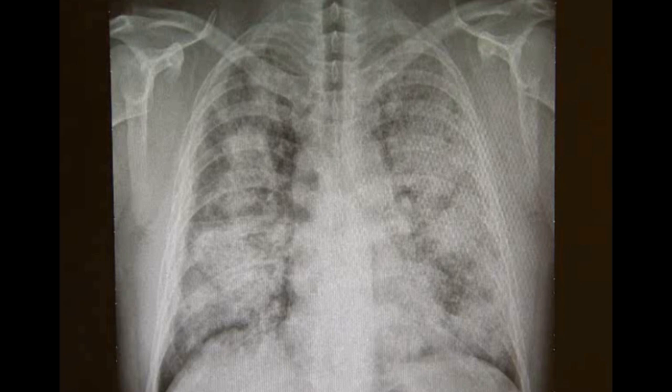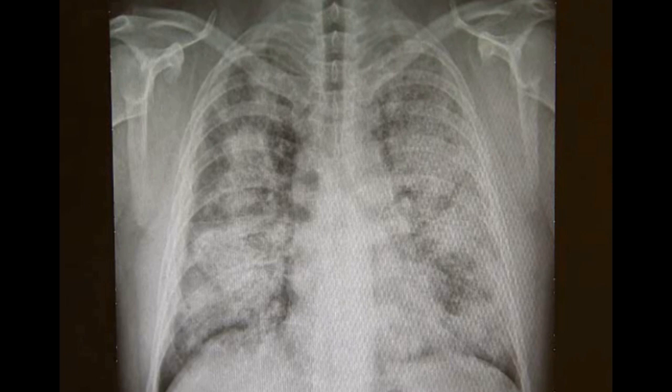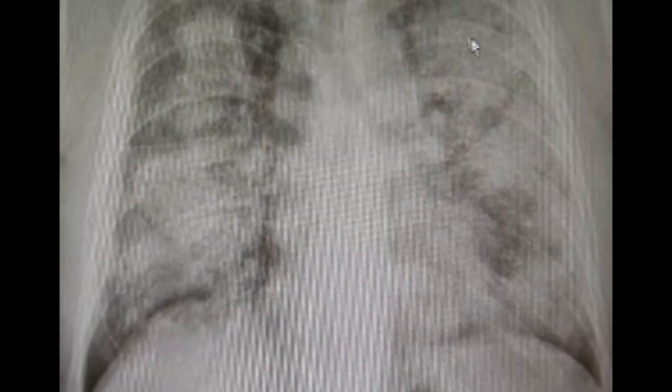At our institution, we do both lungs in the same day at the same setting. We look at the x-ray, and as you see here, the typical x-ray image showing the accumulated proteinaceous material in this patient's lung.